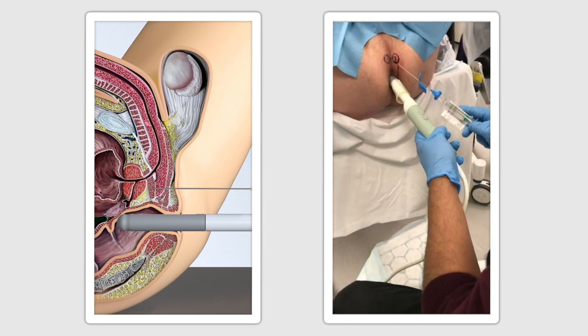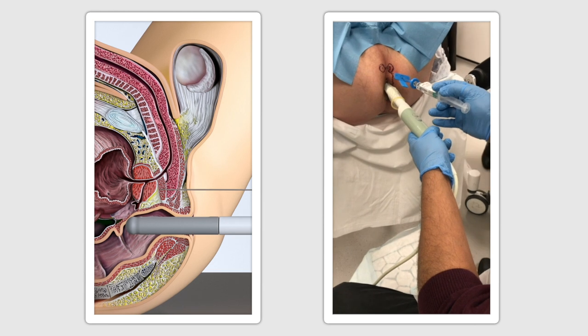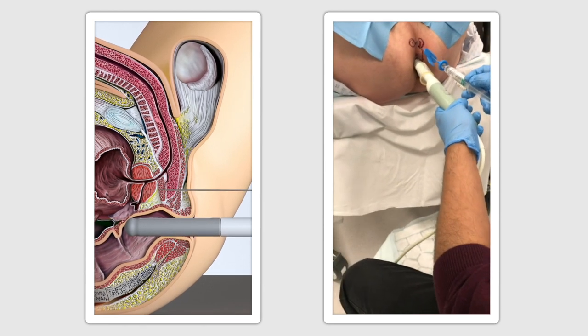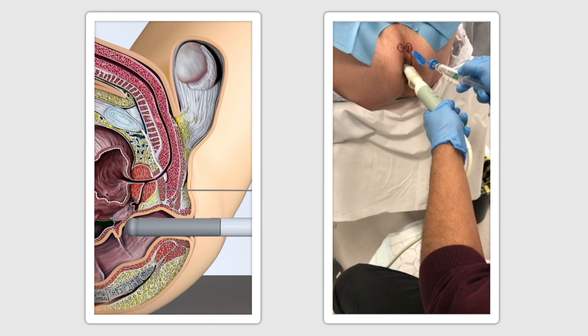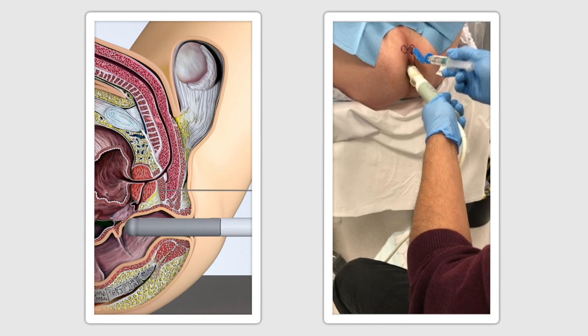Using the ultrasound probe, the assembled CAMPRO device with an attached 10ml local anaesthetic syringe is then inserted at the marked points. If there is any resistance or the skin feels particularly resilient, a small stab incision using a blade can be used on the pre-anaesthetised skin.